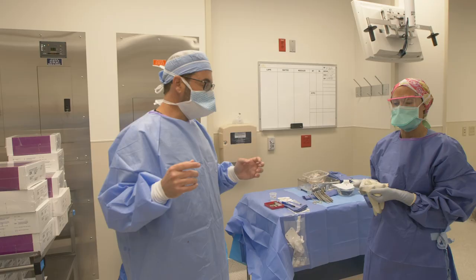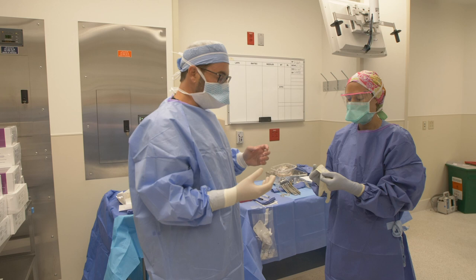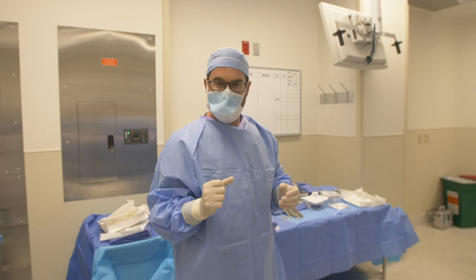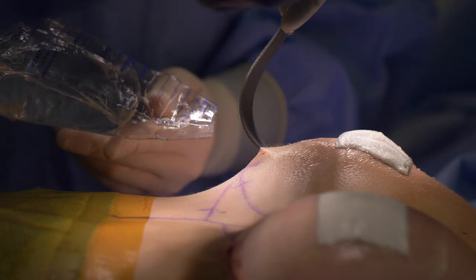Our pockets are dissected and we're ready to put the implants in. We like to use a no-touch technique: first we change our gloves so we have fresh gloves, then we use what's called a Keller funnel to get the implant into the pocket without it touching any of the skin or other surfaces, so it literally goes from the sterile packaging directly into the body.